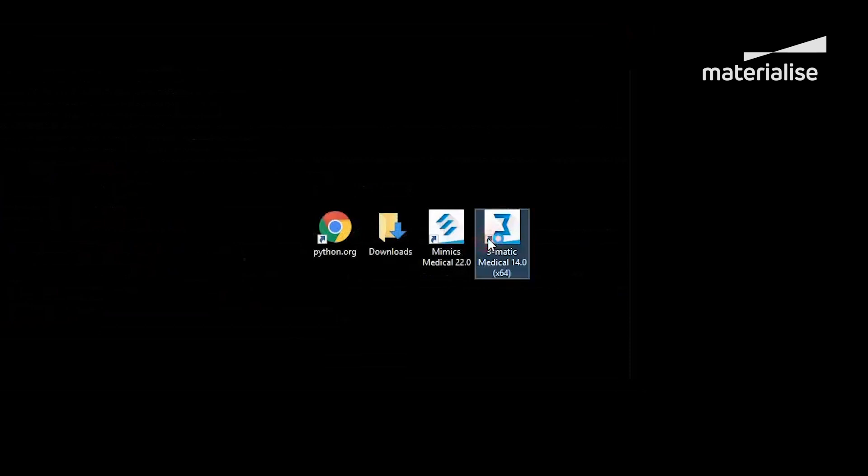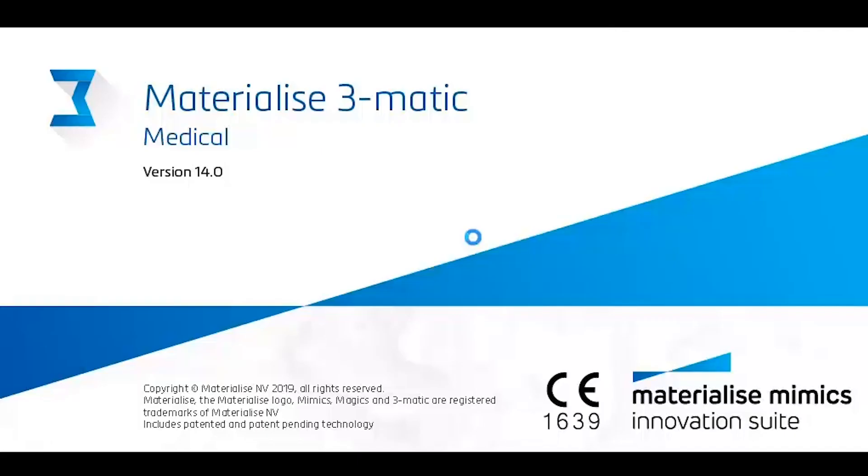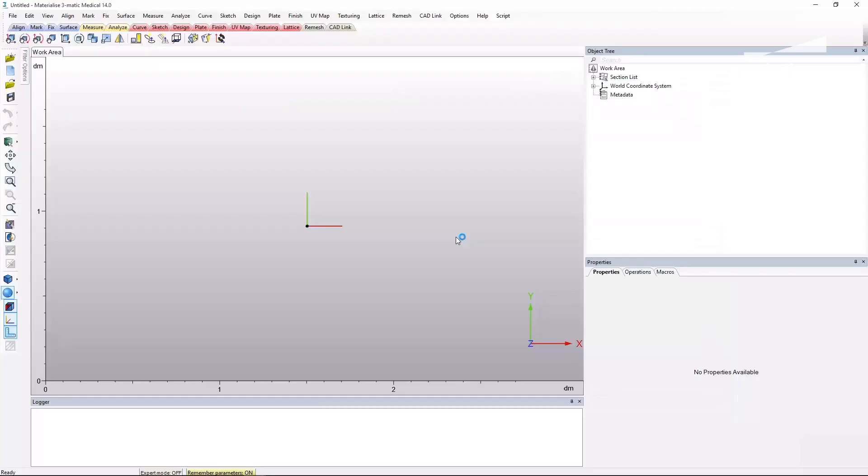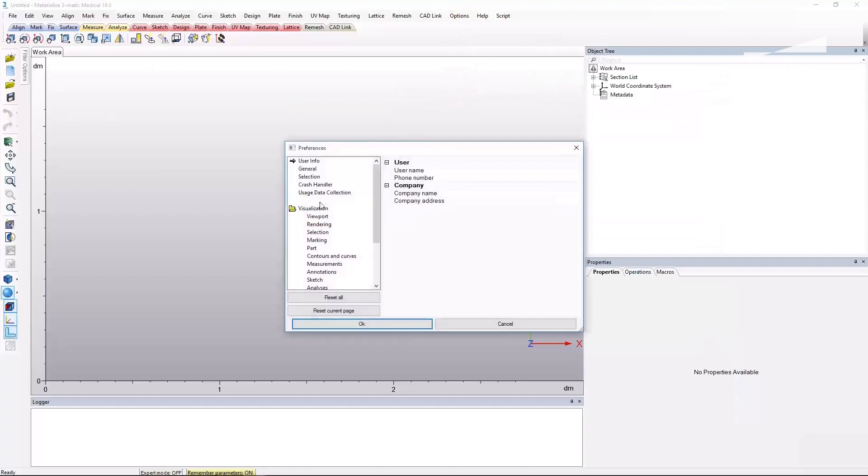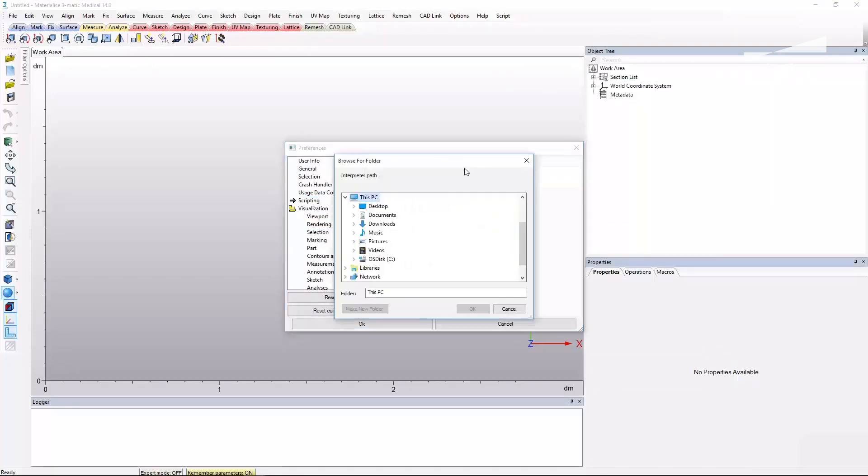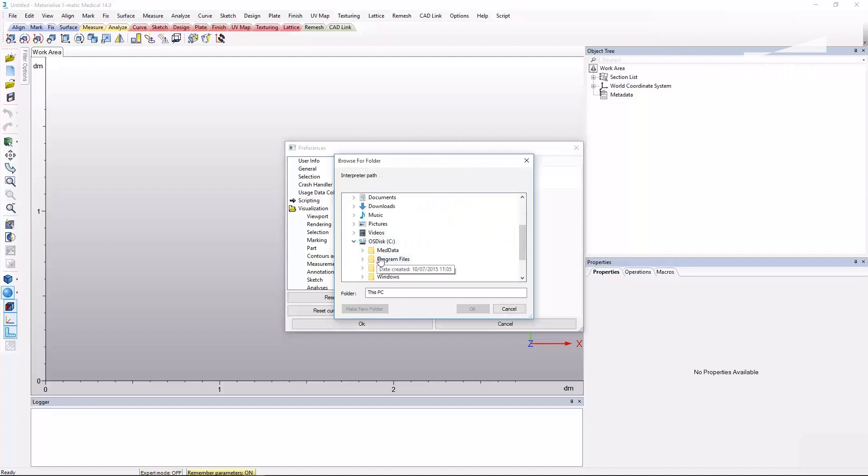Lastly, I will show you how to set up Materialize 3-matic for scripting. The first step is to launch 3-matic and go to the preferences menu. Switch to the scripting tab and browse to the location of your Python installation to select the correct folder.